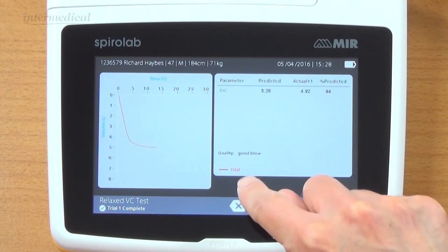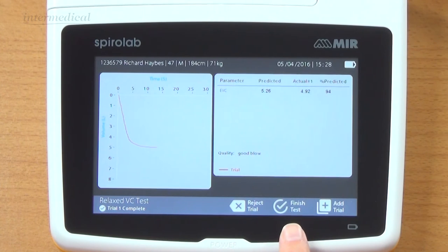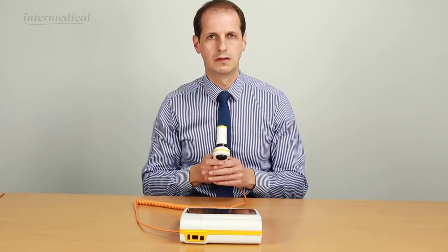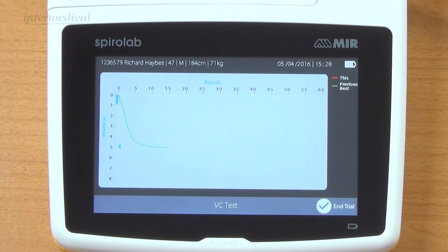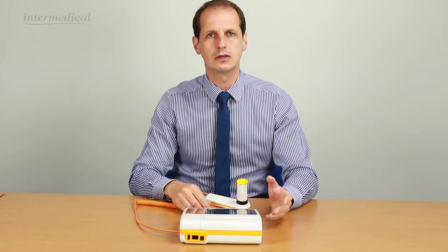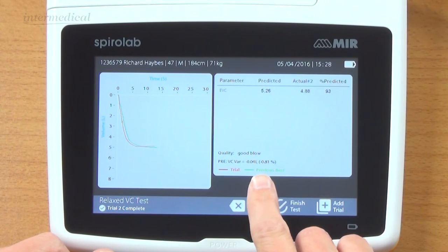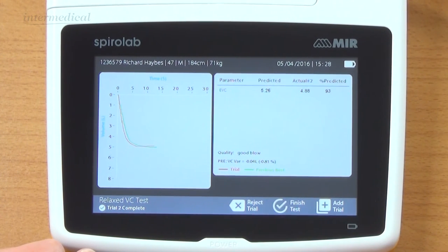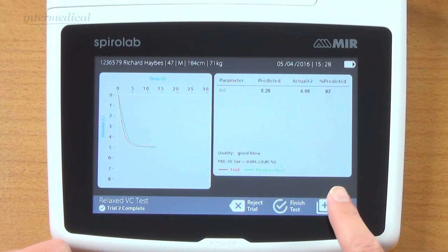The red one indicates my current trial - you could reject that if you wanted to. We could finish the test or add another trial. There's my second graph, now overlaid on top of the first one, and the variation comes up. It was 0.04 litres variance and minus 0.81 percent - pretty reproducible. It says it was a good test again, and we can see that compared to predicted. We can add one more.